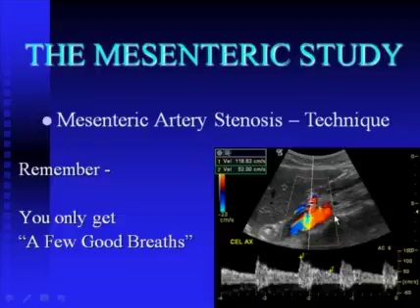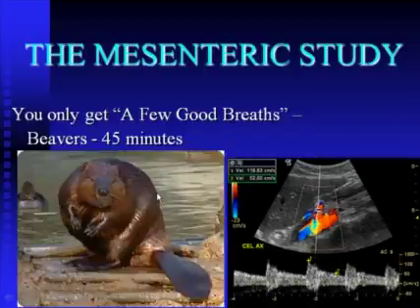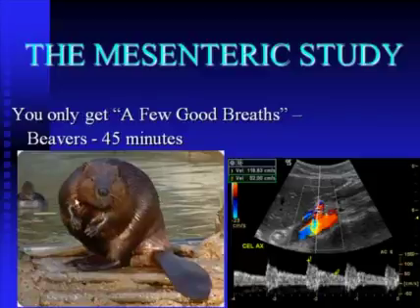And finally, remember, you're going to want your patient to hold their abdomen as still as possible during some of these measurements, which means they will not be breathing during the course of your spectral Doppler recordings particularly. And you're only going to get a few good breaths from this patient population. So you want to use them wisely and coach the patients appropriately.